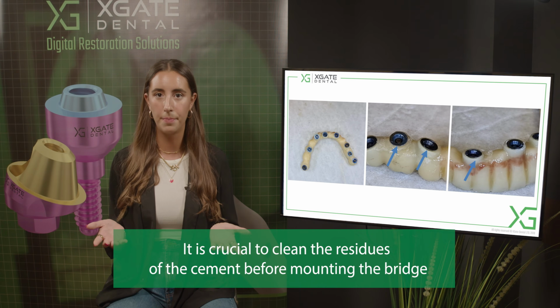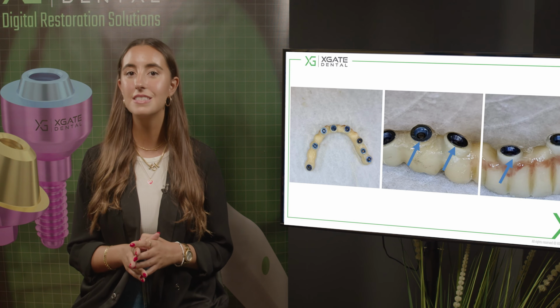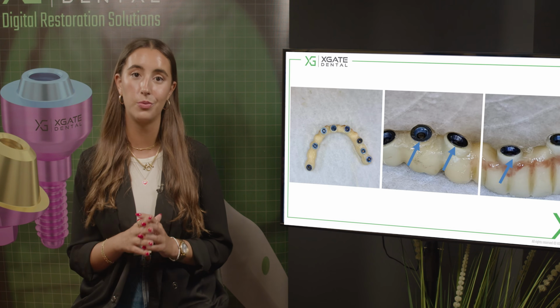So why did it happen? This deviation when we do the impression. The technician placed the scan markers on the impression that we took.